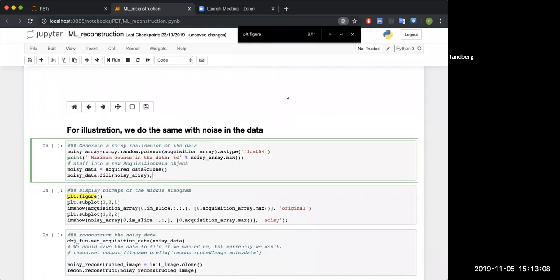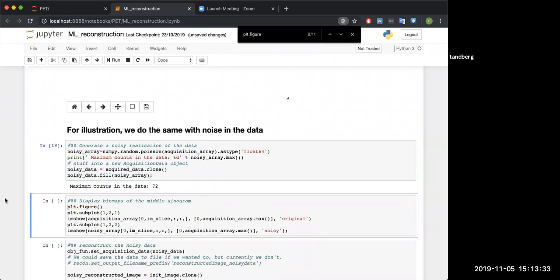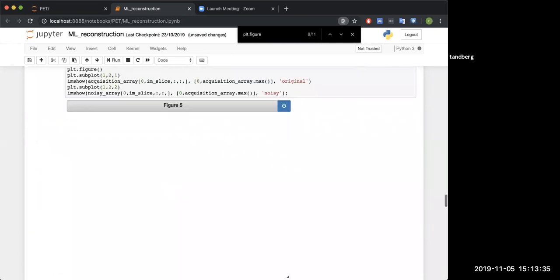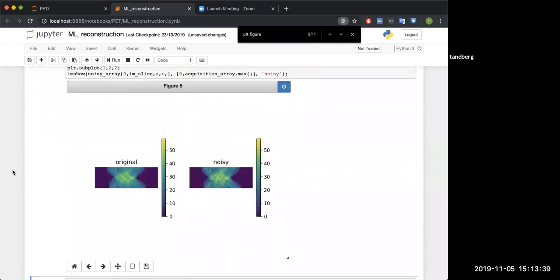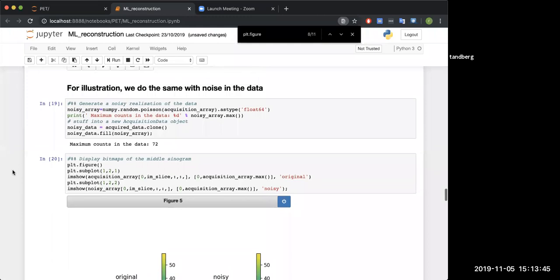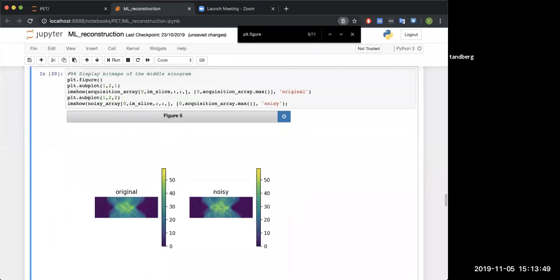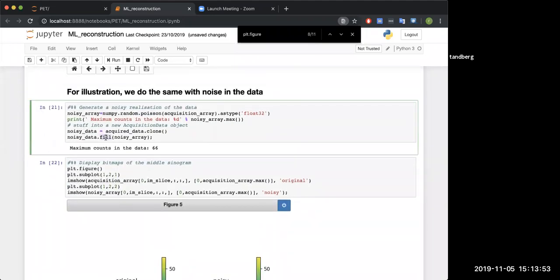In reality, when you do an acquisition, there's going to be some noise in there, some Poisson noise. So we're going to add that in. We do that by using this NumPy method called random.poisson. I'll give it my original sinogram, and then I'll add some noise to it. Then I'll feed that noisy NumPy array back into my noisy sinogram.